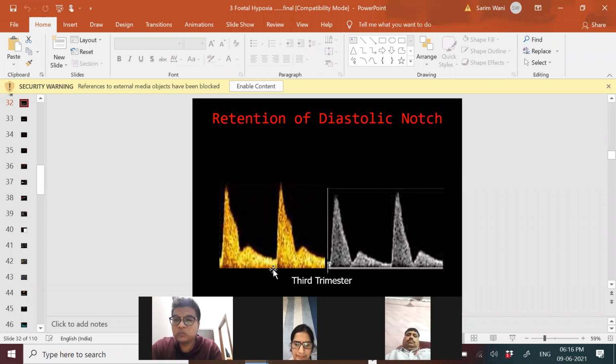Think logically. Ultrasound is not a photography. Will the blood flow be increased or decreased in case of an infertile patient when we are talking about this uterine artery? Decreased or increased? Think. It will be decreased, not increased.